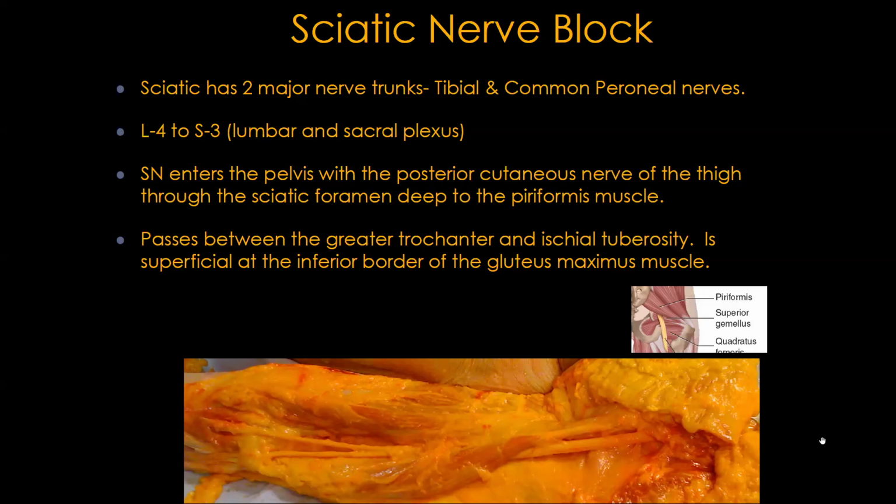like this big. It's not like this big. It's like this big. So you can find it. But how you find it is you push hard with the probe and you change your angle. That's called angle of inclination, because nerves are like an accordion. They're not in one plane. So if you change your angle, it'll pop out at you.